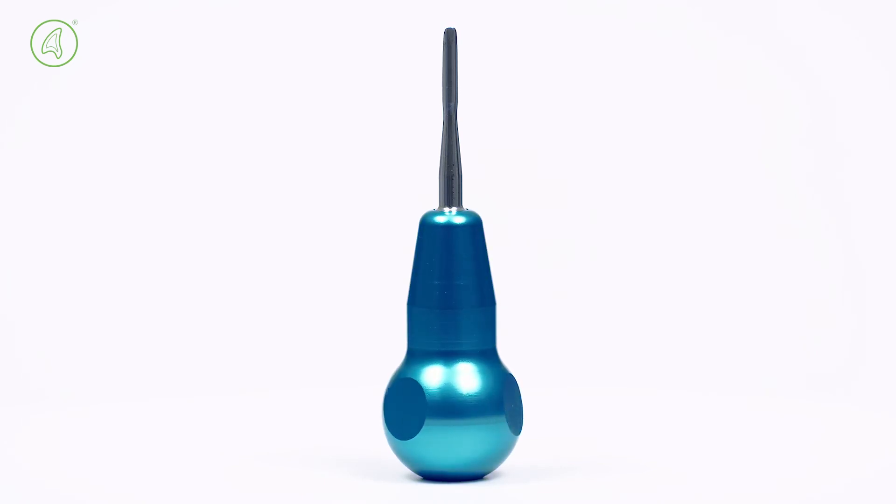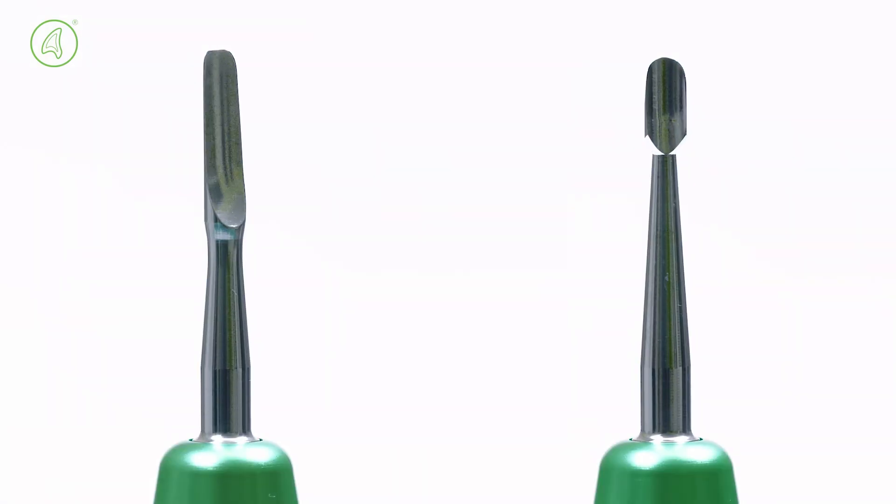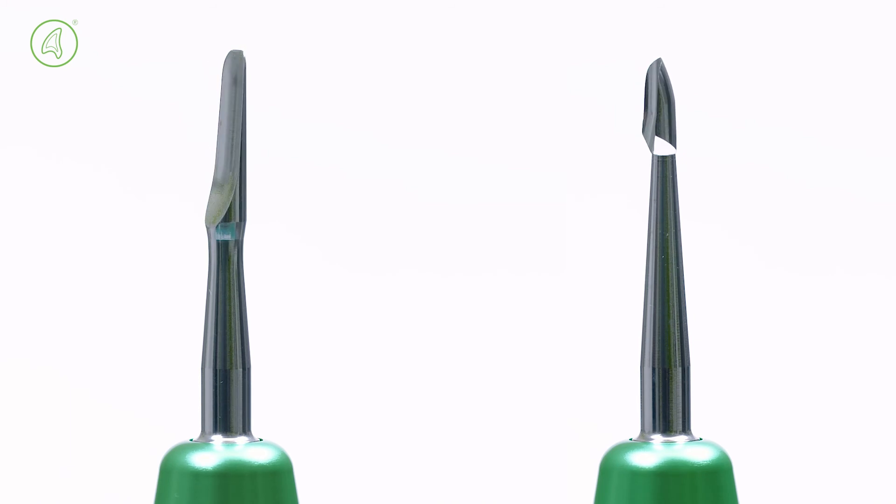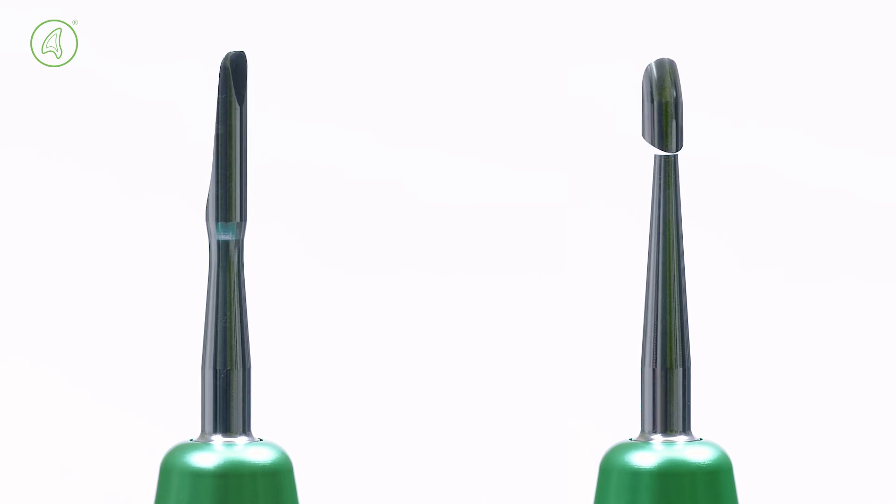Dentonomics make animal dental surgery easier, faster and safer. And the replaceable blades make it easier to maintain sharpness at all times.